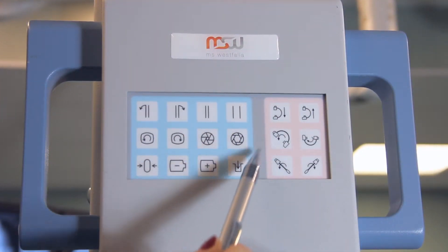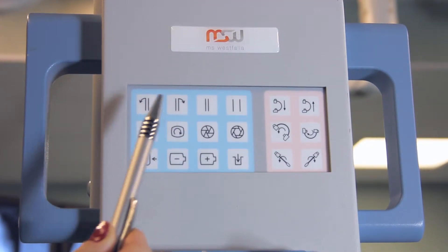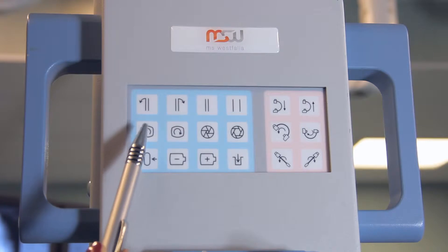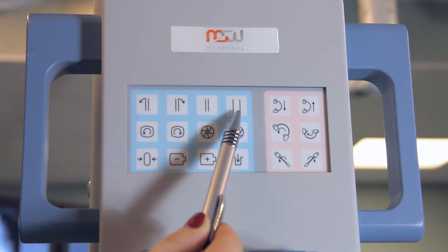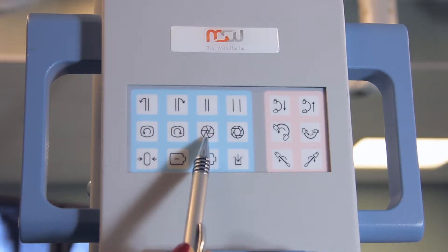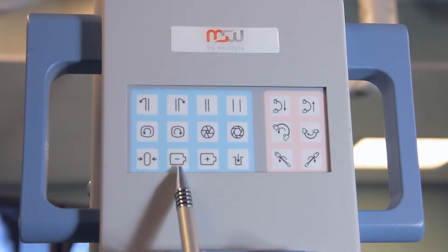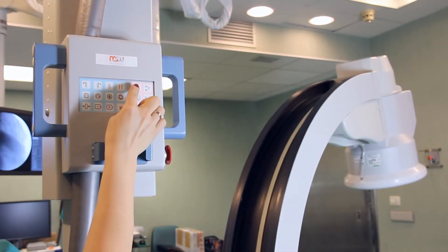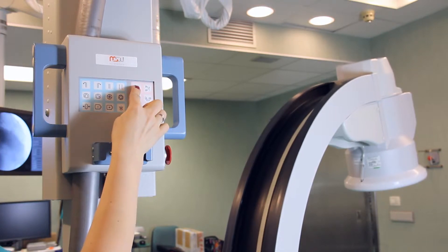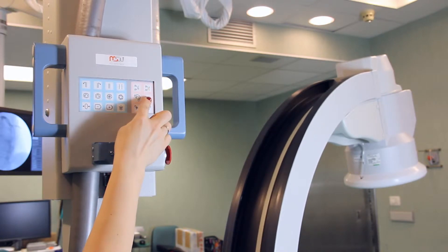An additional control panel is located on the side console of the stand. The turns of the rectangular diaphragm are marked with simple symbols: image turning clockwise and counter-clockwise, control of rectangular diaphragm blinds, control of the iris diaphragm, reset button for the timer, control block for image intensifier, and manual lifting of the C-arm stand. The control block for C-arm movement is highlighted with a special color, duplicating the control by joysticks.